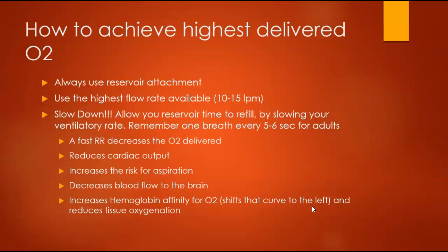You're also increasing the risk of aspiration by hyperventilating, especially before you have an advanced airway in. If I'm just bag masking my patient, I'm hoping I'm doing a good job, and most of that air is going to end up in my lungs. But no matter how great I am at this, some air is going to end up in my stomach. Just know going into it that as I'm breathing for my patient with a mask and a manual resuscitation bag, I'm going to be ventilating the lungs, but some air will be entering the stomach.